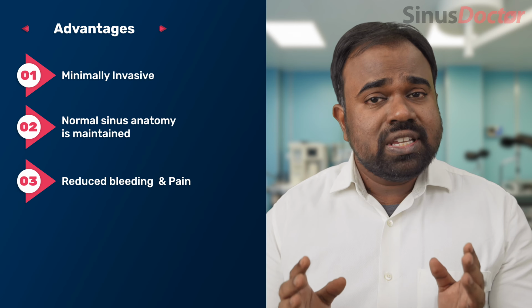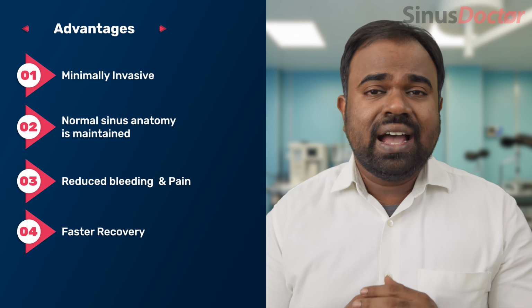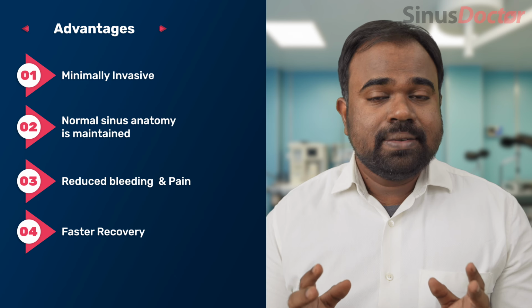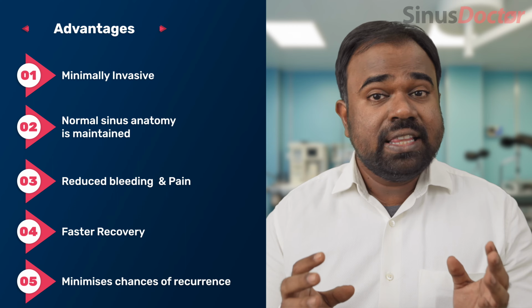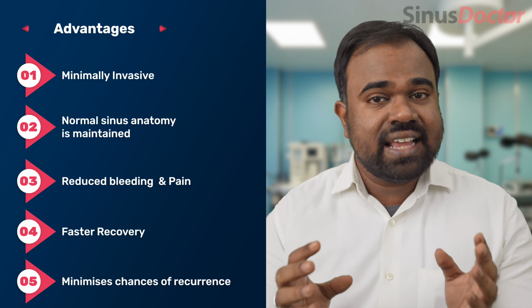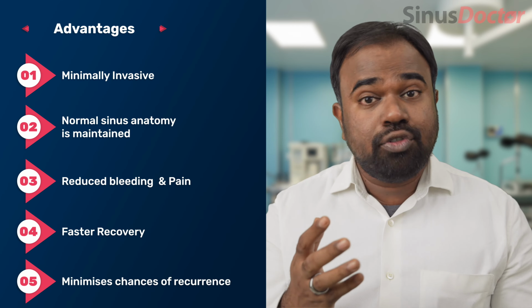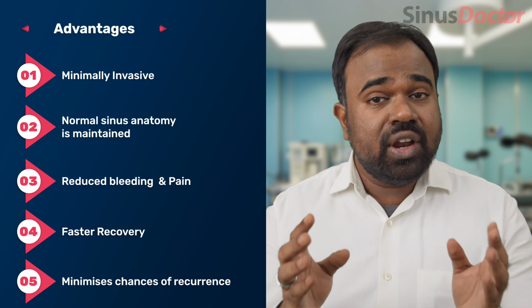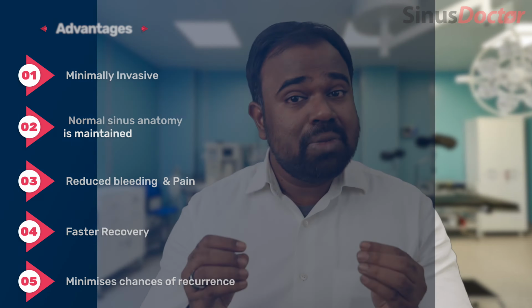Also, when balloon sinuplasty is performed, the recovery time of the patient is shortened and the patient can return very fast to his normal activities. Not only this, there are certain sinuses which are prone to restenosis when the mucosal lining inside the sinus is damaged. This is especially true for the sinuses above the eyes, that is the frontal sinus. So when balloon sinuplasty is used for opening up the drainage openings of the frontal sinus, the chances for restenosis are very much minimized. Now let us talk about the disadvantages.